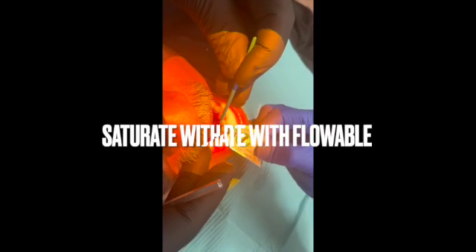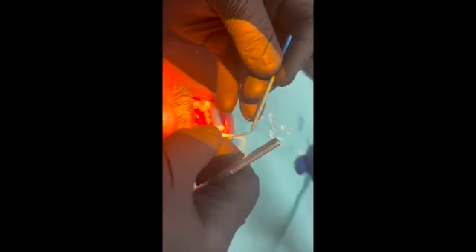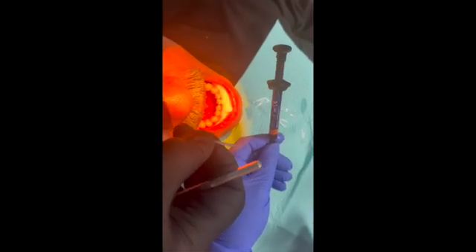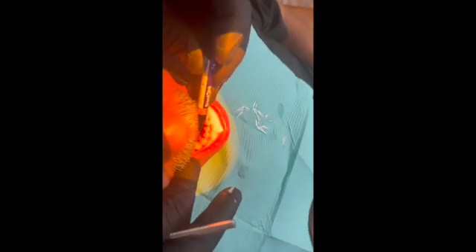After etching and bonding, I like to saturate the splinting material with flowable composite before I put it on, just to get it wet. I'll put some flowable on here and just kind of let it penetrate. I don't want to cure this yet — I'm just getting it wet with the flowable composite.